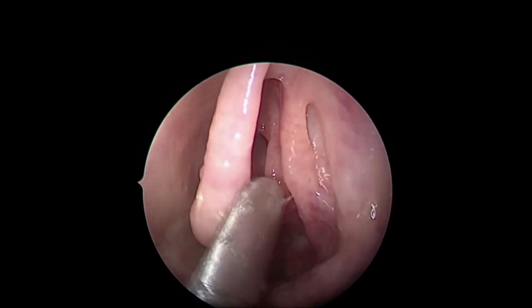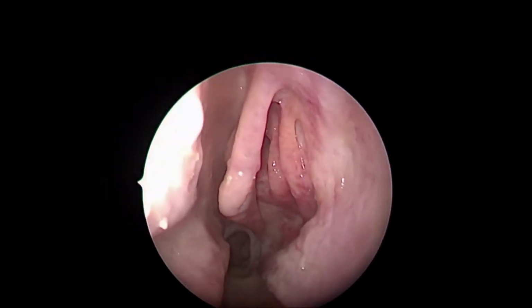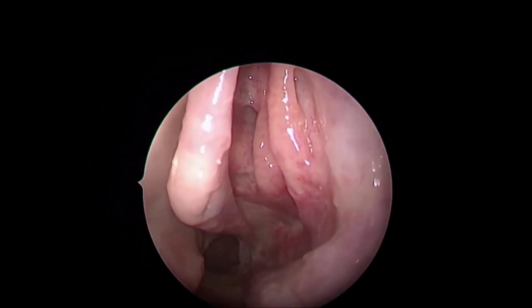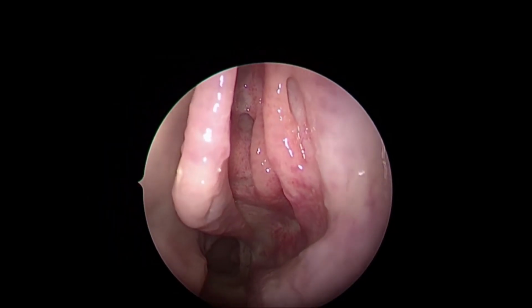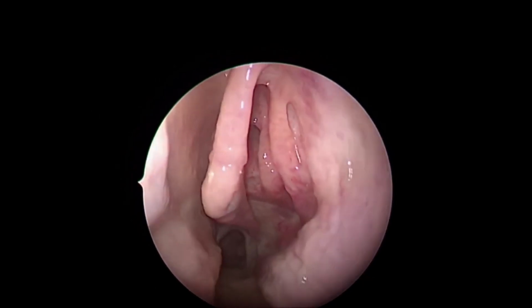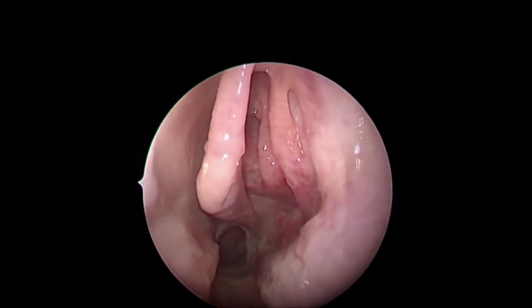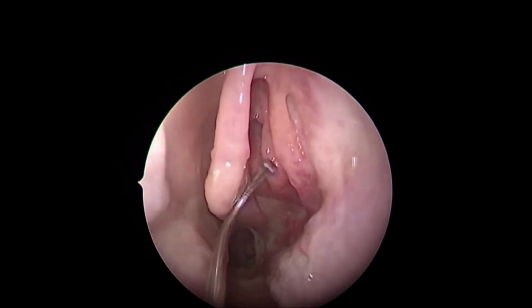Can you see this mobile structure? Yes. That's the only mobile structure in the entire lateral nasal wall. That is known as the uncinate process, and it has a huge bearing on the drainage flow, or the outflow, of the frontal sinus. We'll see. We have discussed this in the radiology also.